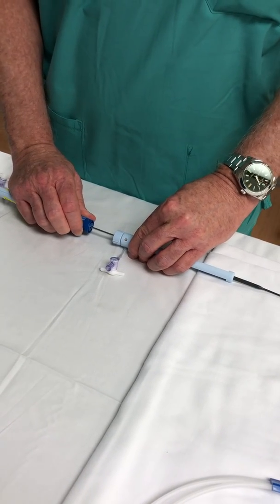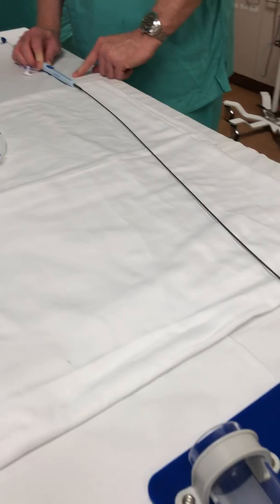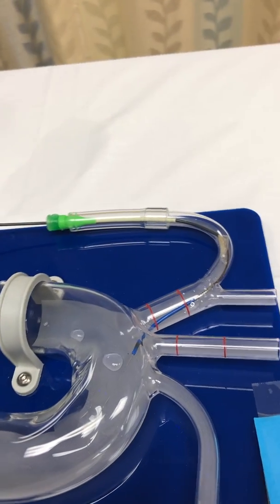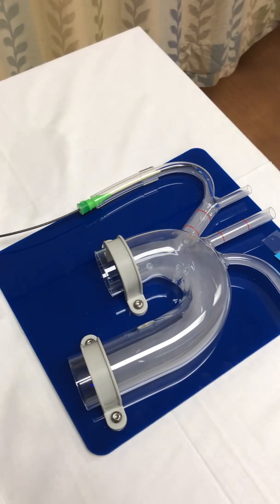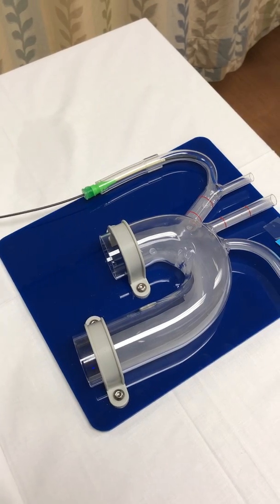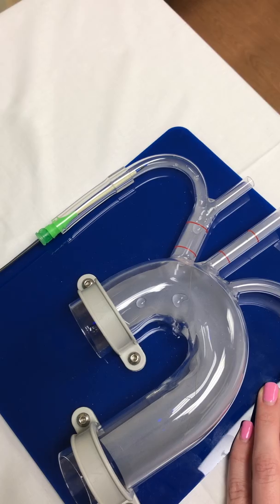As a troubleshooting note: you cannot resheath the number one proximal filter unless your handles are totally together. Now we're going to slide number one forward to fully resheath it. Then, holding your thumb at the tip to keep the catheter together, you withdraw the device out of the radial artery. And that completes it — in at 250 ACT, out at ACT of 250, and the device gets extracted.